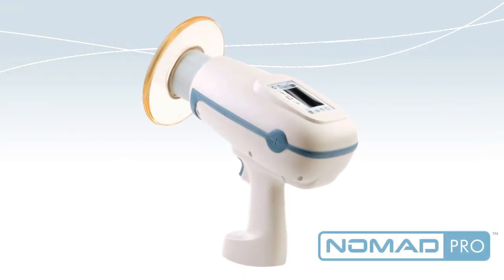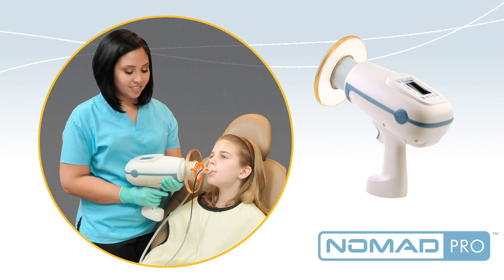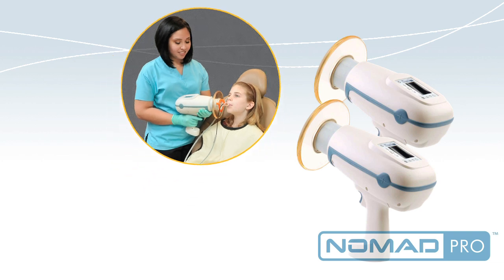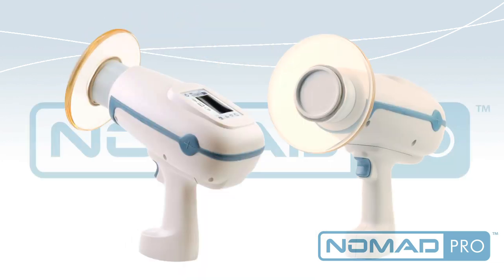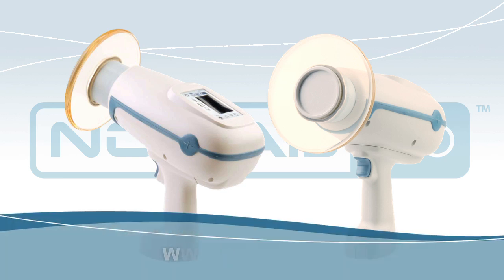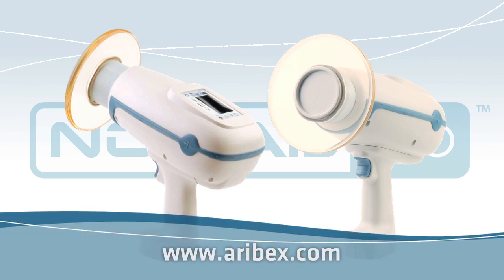Nomad Pro is convenient and cost-effective. Since it goes easily from room to room, most offices would require only two Nomad Pros for every six operatories. Nomad Pro has changed the way intraoral x-rays are taken in the modern dental office. Starting now, being off the wall is a good thing.